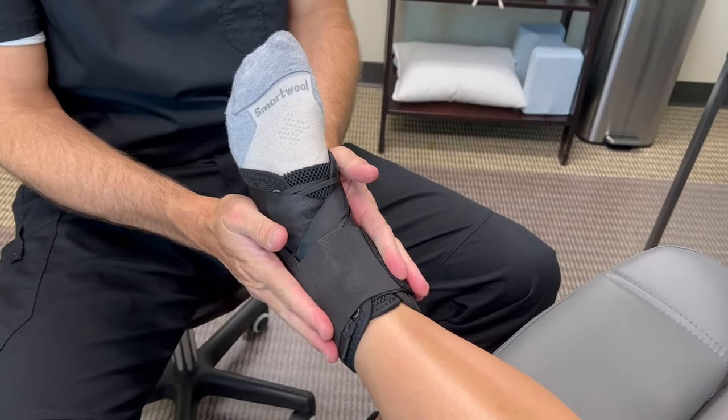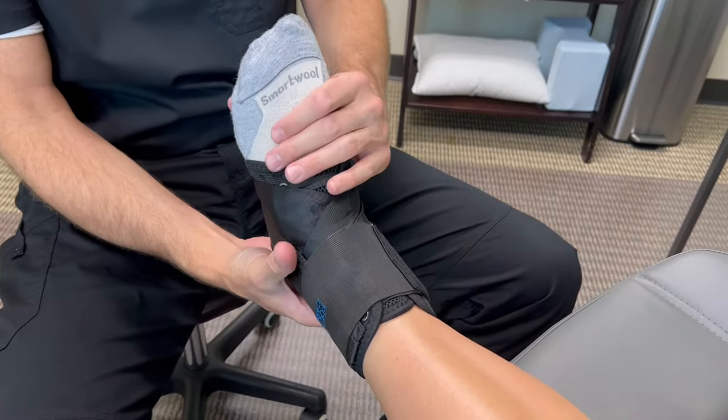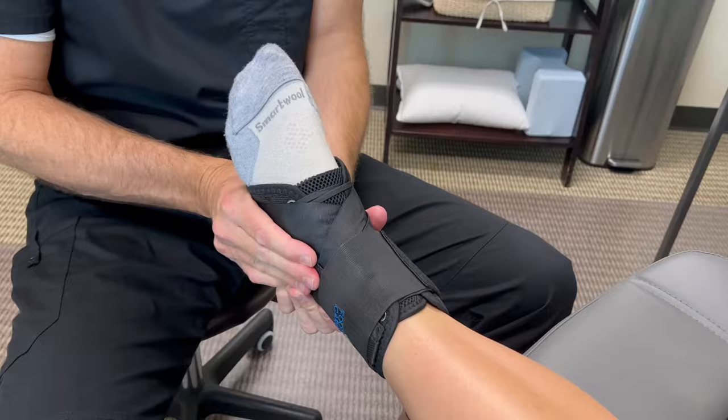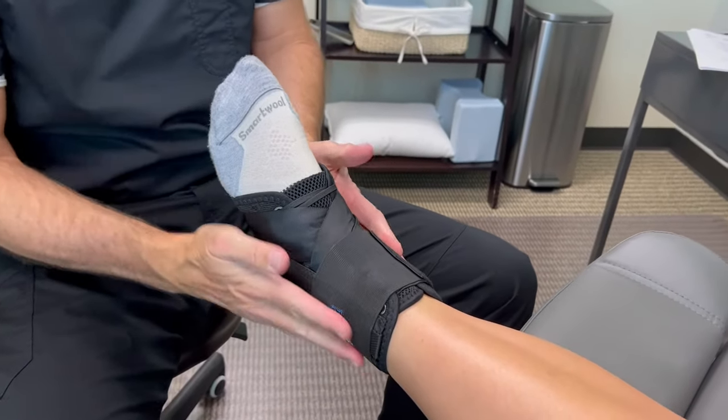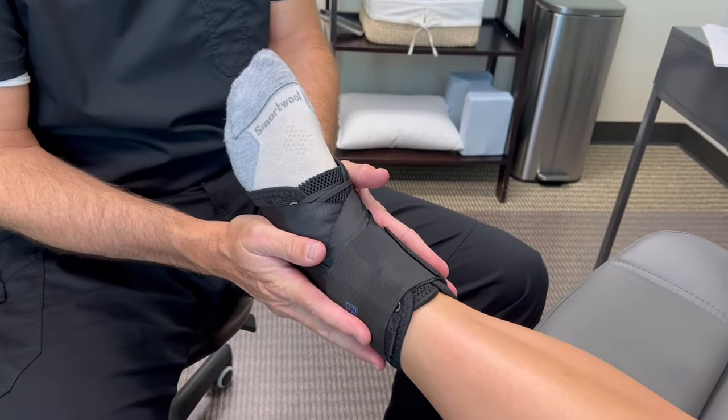What we're trying to accomplish with this brace is to let your foot and ankle move up and down, but we're limiting that side-to-side motion to help with the medial and lateral stability of the ankle.